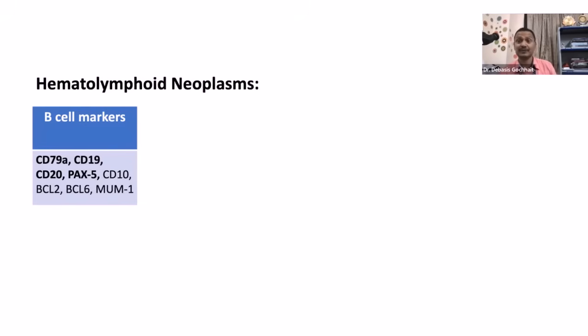Now coming to hematolymphoid, we know there is the hemat and the lymphoid, so many. We have talked about Hodgkin's, but there can be B-cell lymphomas, there can be plasma cell disorders, there can be myeloid tumors, myeloid leukemias. So many types of tumors, histiocytic tumors. So we will need some specific markers for them. Again, when we have an NHL, we have to categorize whether it is a B-cell lymphoma or a T-cell lymphoma, because therapy is very different. Remember, stressing on it, categorization is very important from our perspective, because the clinician has to give a specific therapy. B cell different, T cell different.